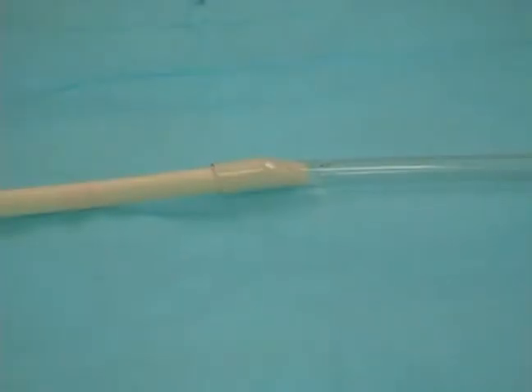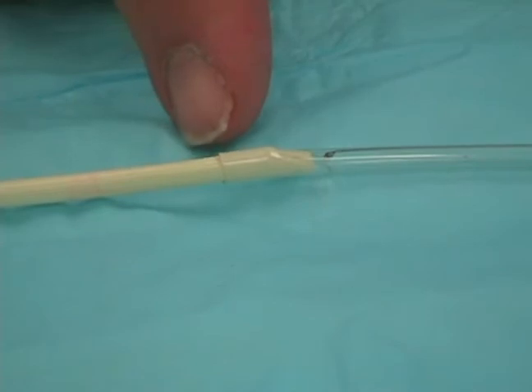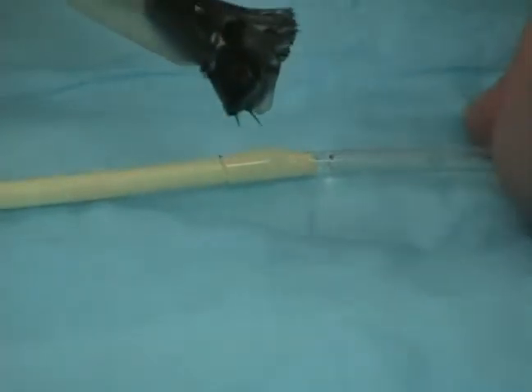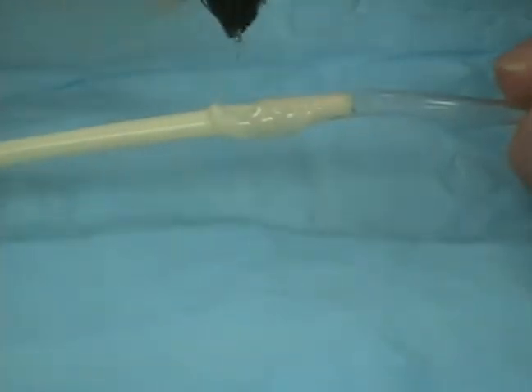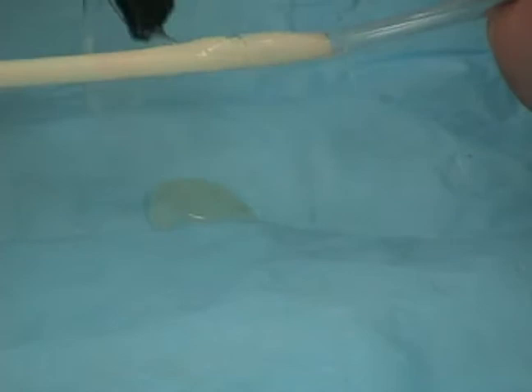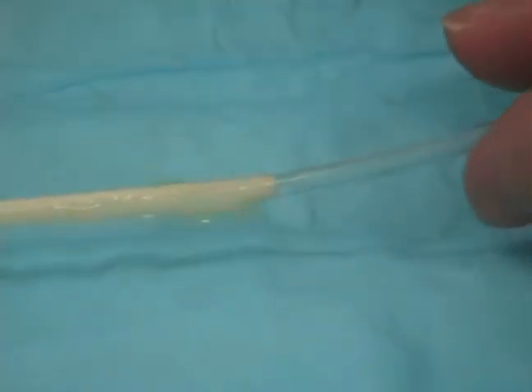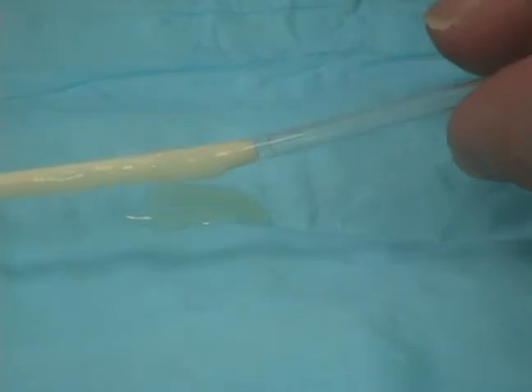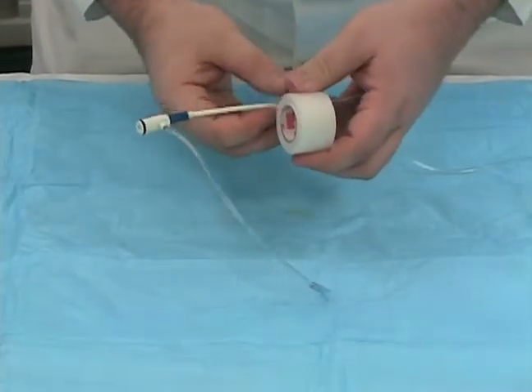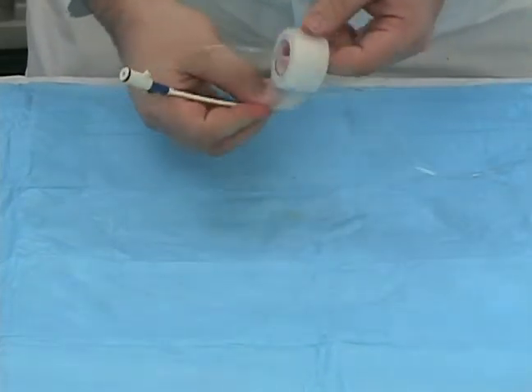cordis into the tubing. As you can see, it's been inserted approximately half an inch, but this itself is not sufficient to keep it in the end of the tubing. Apply a dab of rubber cement around the joint. And now allow this to sit and dry for at least 24 hours. Once it is dry, apply tape to add an additional protection against leakage and accidental removal.